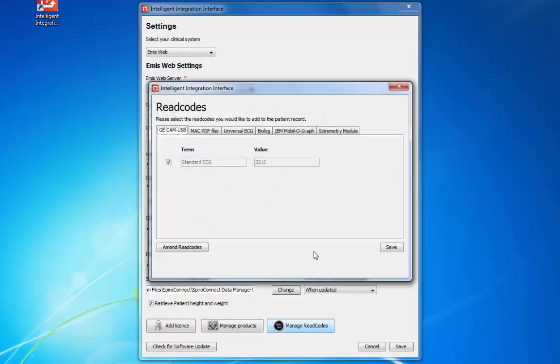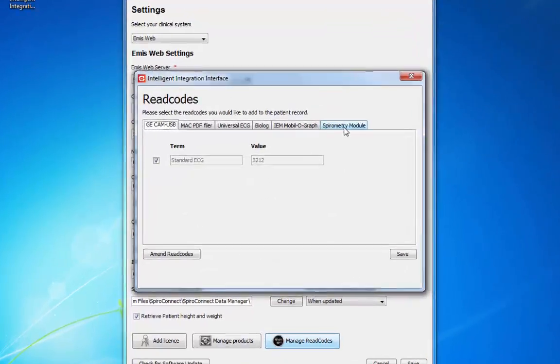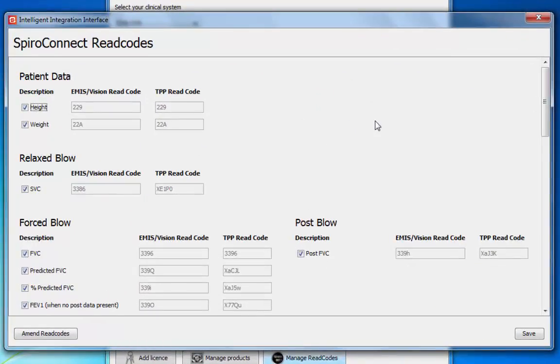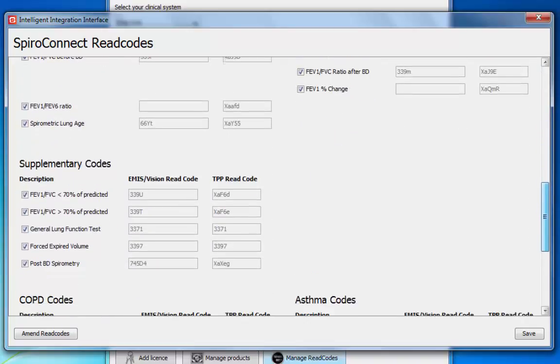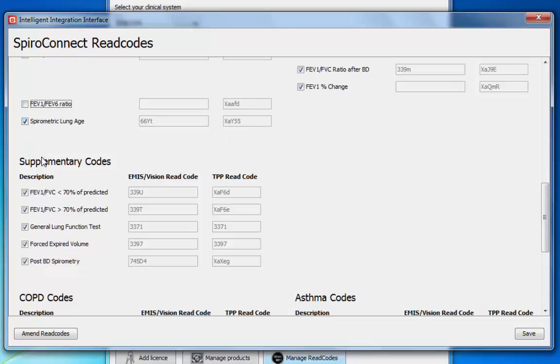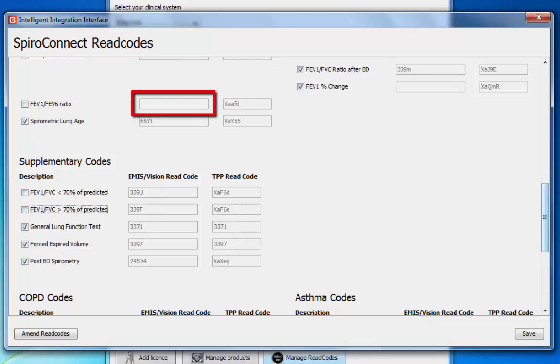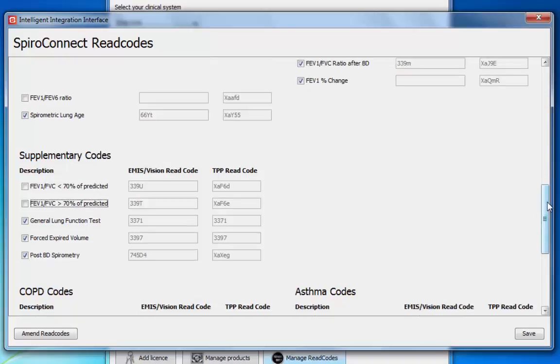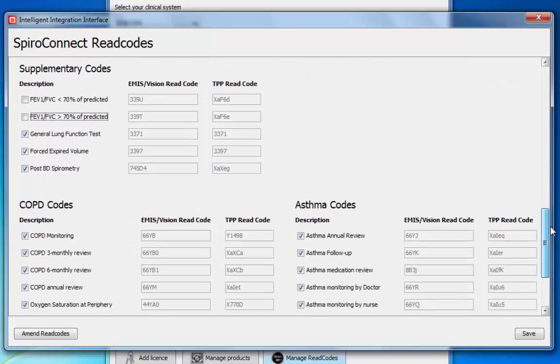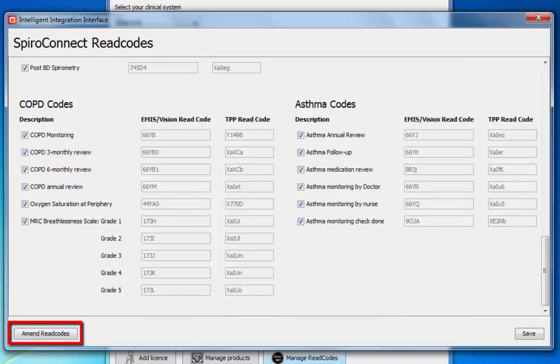Click the Spirometry Module tab. A list of all the available read codes will be shown. You can disable the filing of specific read codes by deselecting them here. If a data value has no corresponding read code shown, the read code is not available on that clinical system. It is possible to change the read code against which a particular parameter is filed — please contact our technical support team for assistance in amending read codes.